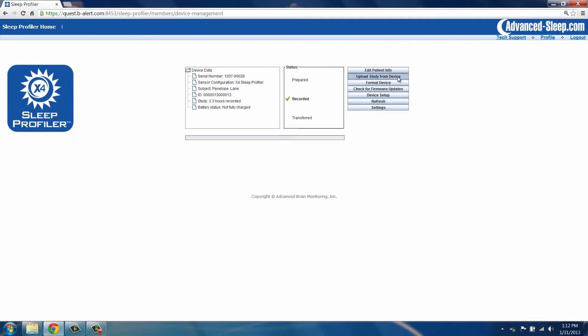The device status should be recorded, indicating that a study is available for upload. Press the Upload Study button. You must keep the window showing the progress bar open for the file transfer to the Sleep Profiler portal to complete.